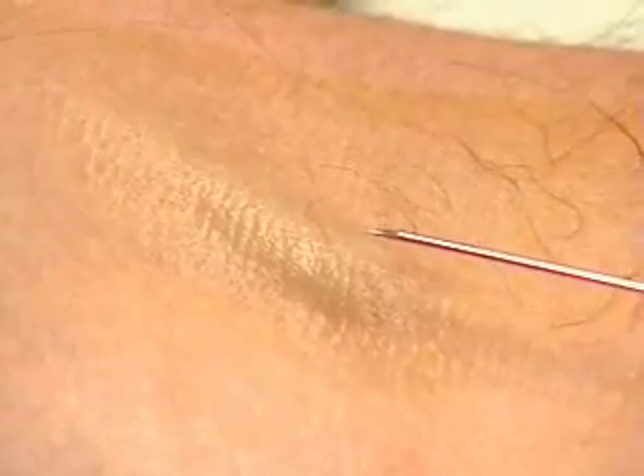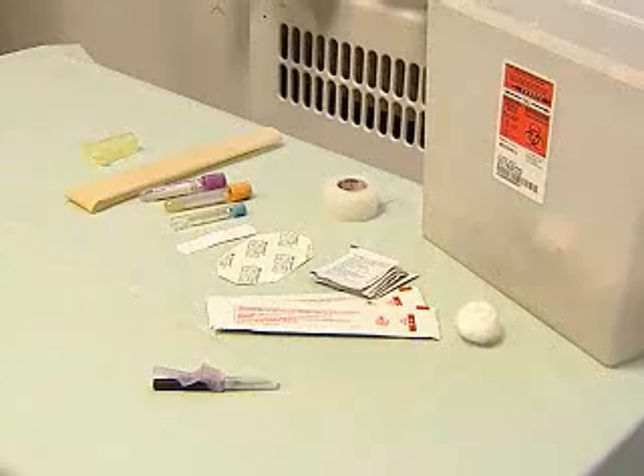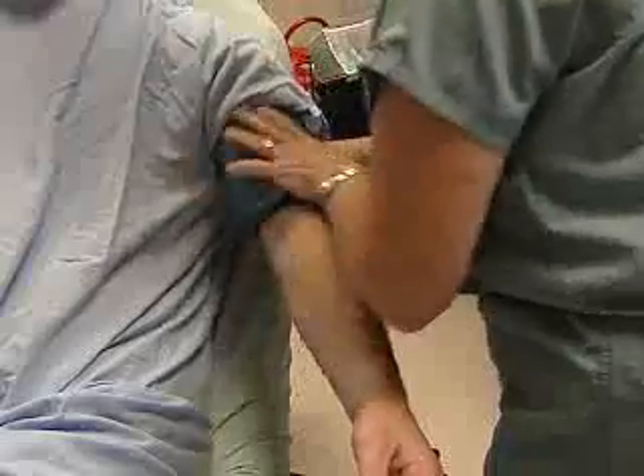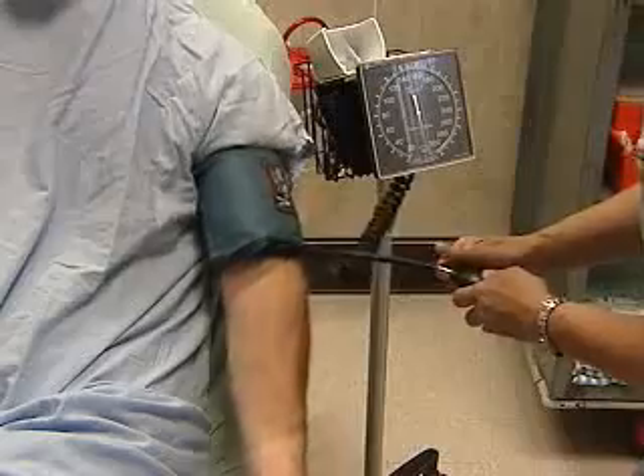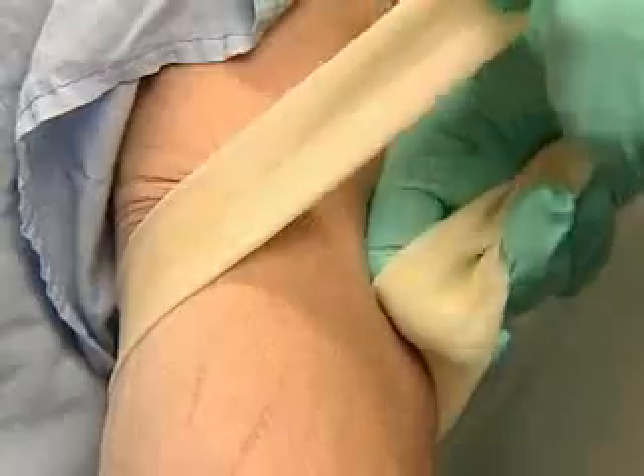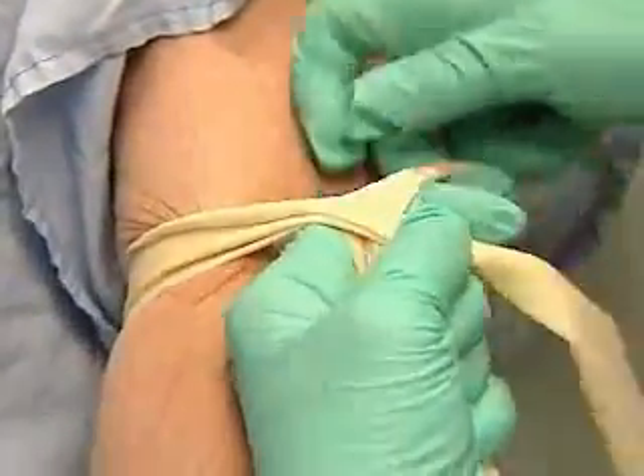It's one of the most common procedures you'll learn. We begin with the needle, vacutainer, and blood tubes. A blood pressure cuff can serve as a tourniquet to help you raise a good large vein in the antecubital fossa. Tying the tourniquet properly takes a little practice.